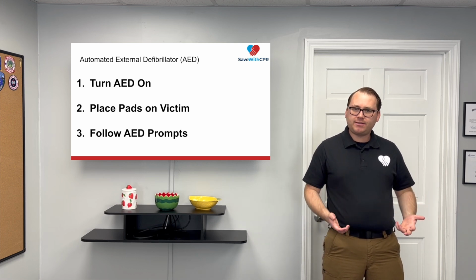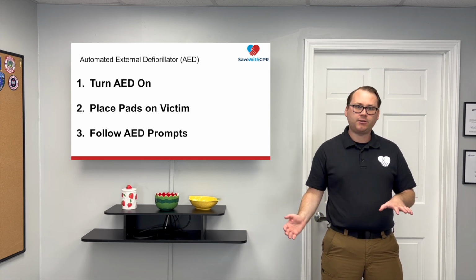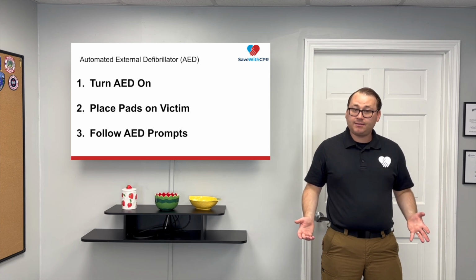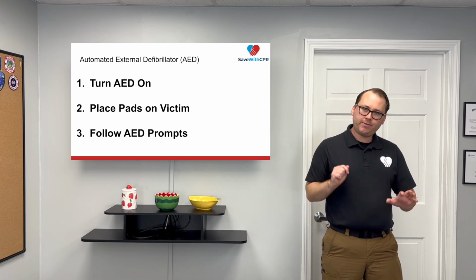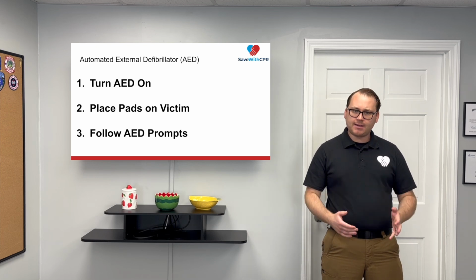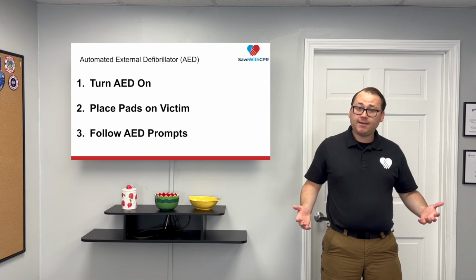And if it needs to be reset, the AED is going to say, stand clear, shock advised, it's going to charge up. And then it's going to say, shock advised, the red light will flash, you hit the shock button, a jolt of electricity goes through the victim in an attempt to restart the heart, you immediately go back into your chest compressions. And that's the AED.